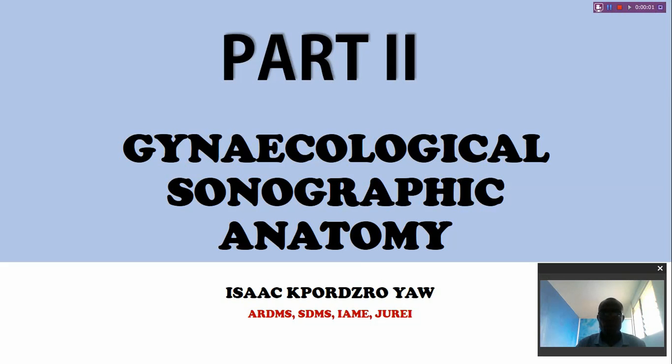Welcome to part 2, Gynecological sonographic anatomy. As we studied in part 1, we looked at basic nomenclatures and indications as to how to scan pelvic ultrasound in a reproductive patient. So we are going to look at part 2 of this lesson.